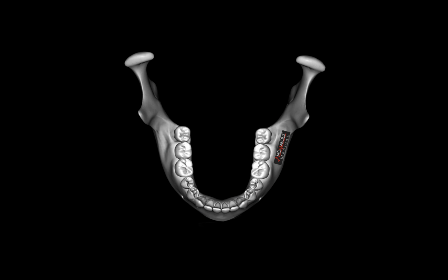Think about it this way. This is a better way to visualize it. Think of a mandible, all right? And then many of us use simple instruments like clackers. They're very, very common. But let's look at the rotational pathways. If we draw a radius from the rotational center of the condyle, and draw a tangent to that, that'll be our pathway excursion. Well, what about if we use this clacker?